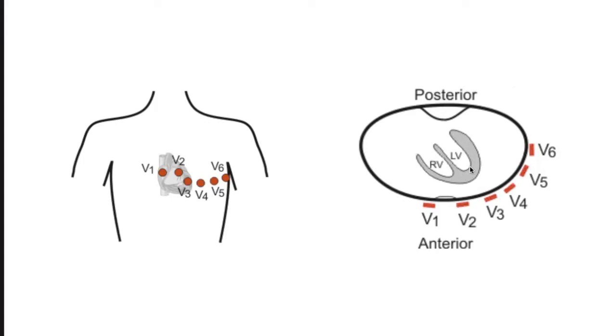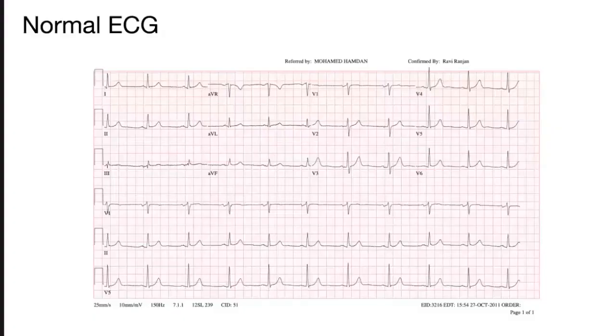So I know I just threw a lot of information at you. I'm going to continue to throw more information at you because we're going to look at some ECGs now. So this is what a standard ECG looks like. If it's normal, it's healthy.